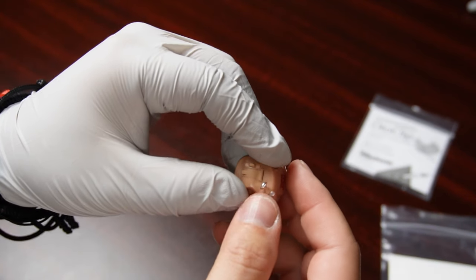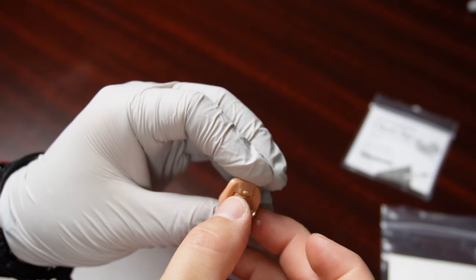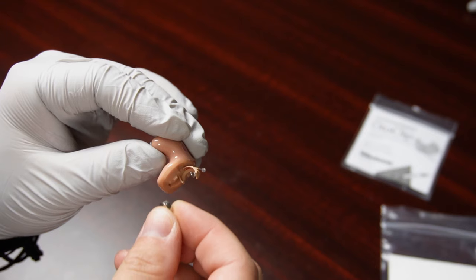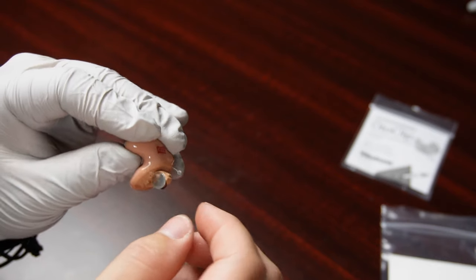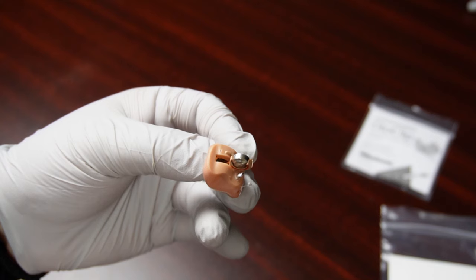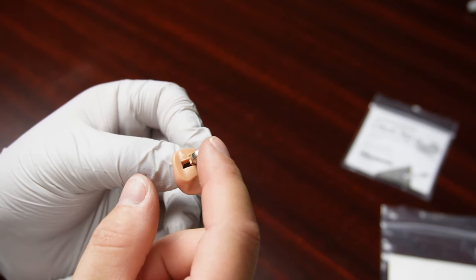Now you can take the Otoclip and clip it right to the hearing aid. I hope this helps you guys out. I know it's kind of hard to find somebody to do this for you, so I figured I'd show you guys a DIY video so you don't have to rely on anybody else. Let me know if you have any questions, and I will also be doing a video on how to retube your behind the ear hearing aids from home.